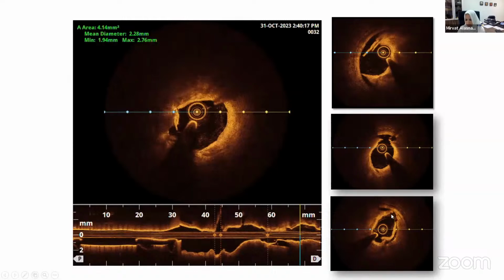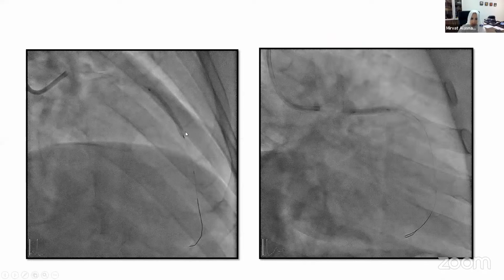And again, as you go down, you see that we fractured. So that one was around 12 o'clock. And as we go further down, you see this was around 1 o'clock. So we were very aggressive in this fibrotic lesion with the modification. And we now know we can safely expand a stent there. So what we ended up doing is placing a stent, and you can see we're placing a stent in cranial view to cover that entire segment. Then we moved to just make sure the proximal segment were at the landing zone of our choice.